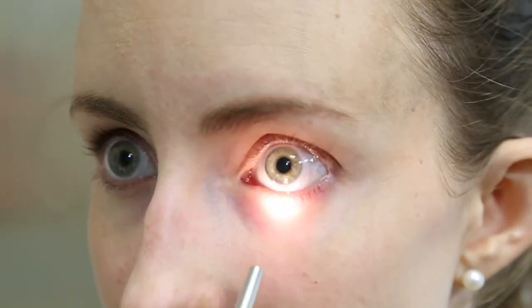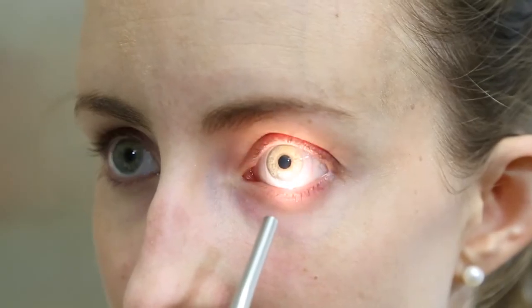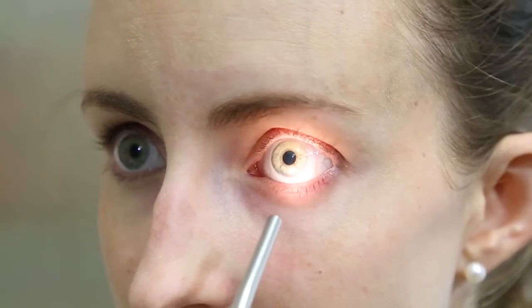Looking in the mirror, shine a light onto the lens to check for bubbles. The flashlight on your cell phone works very well, or you can obtain a small light for this purpose.